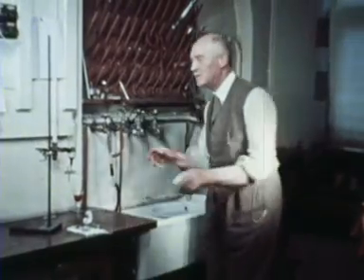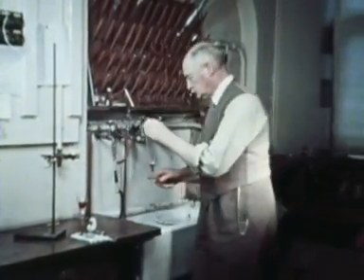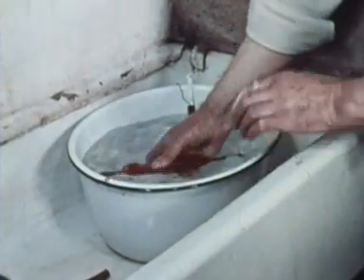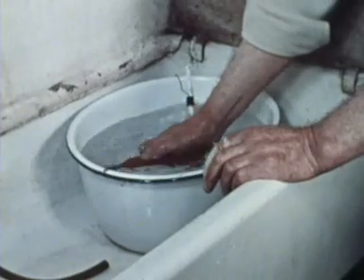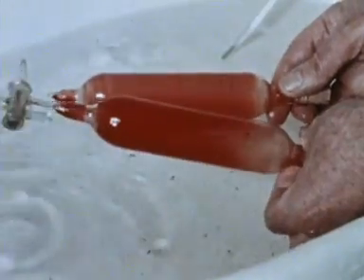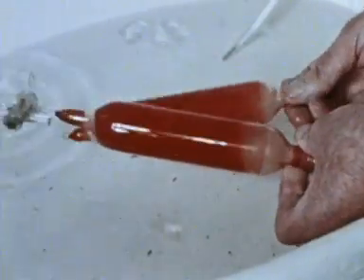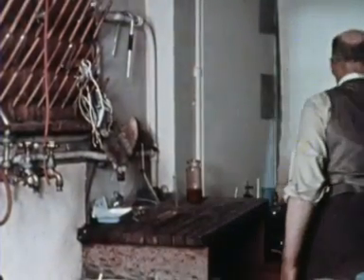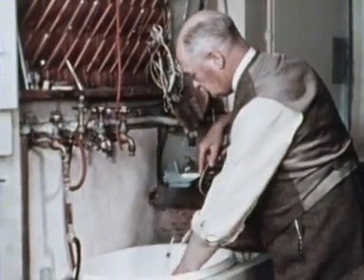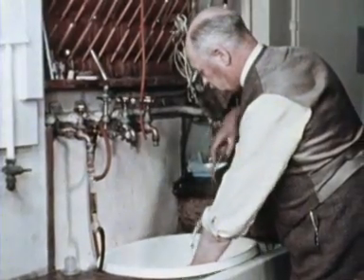Now, before continuing with the experiment proper, my father is going to digress a little and show us the effect temperature has on the oxygen haemoglobin equilibrium. Blood in contact with air is fully oxygenated and bright red as the reference sample at the top shows. The fact that they are both the colour of arterial blood indicates that even with the small volume of air present in the test tonometer, the solution is largely saturated with oxygen in the cold.